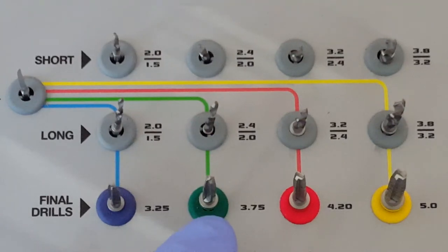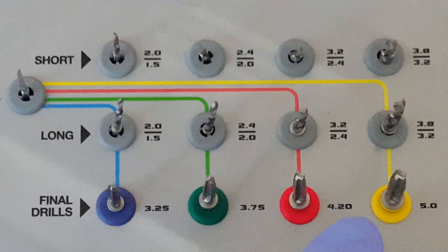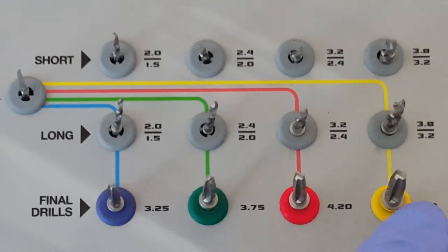The red color signifies the 4.2 millimeter diameter implant, which is also a standard platform implant, and the yellow color corresponds to the 5 millimeter implant, also a standard platform implant.